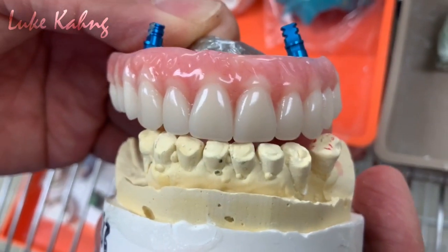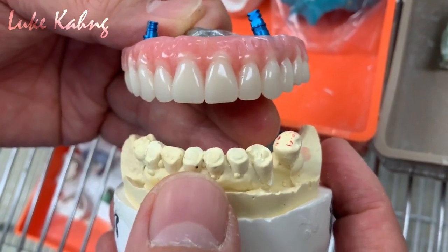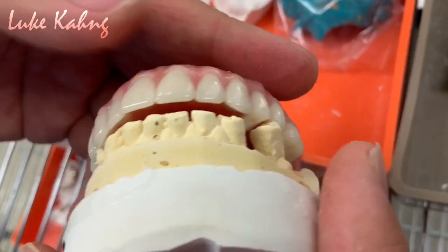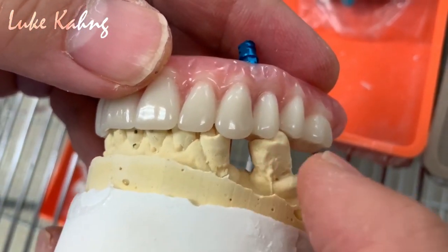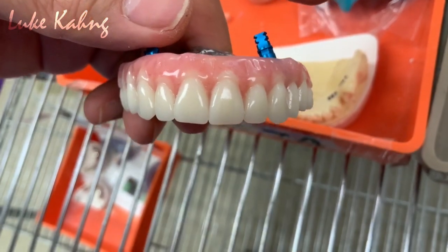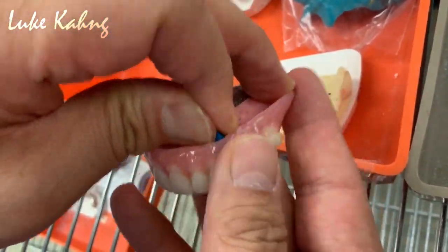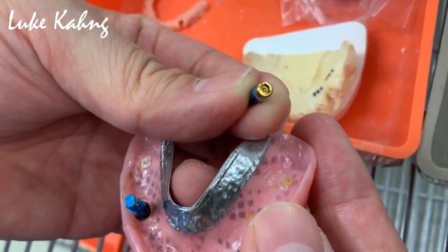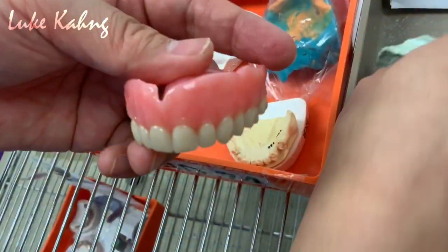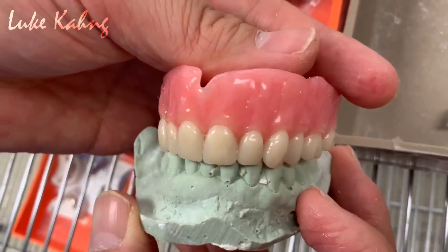Awesome. Alright, 2 locator implants with characterization. This patient, quite everything. Even though we set the wax teeth previously, we just trimmed it a little bit. So I recommend trimming here, otherwise this area of denture teeth is popped out. Aesthetic is great. I'm more worried about the function, even though we made a good mesh. And this is the implant, just like the patient's mouth. Just like what we videotaped, this is the locator. And the other one, the finish is nice. Characterization with the processing. It's a regular deluxe denture case. Great.